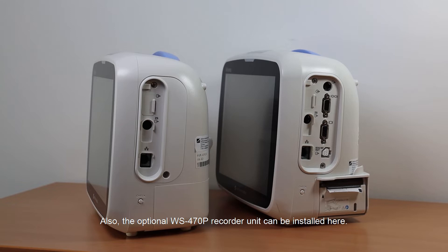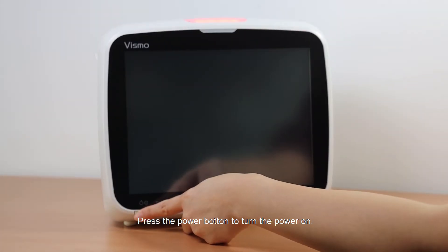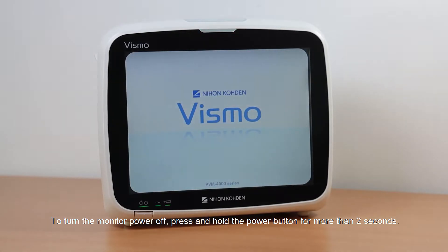The optional WS-4770P recorder unit can also be installed here. Press the power button to turn the power on. To turn the monitor power off, press and hold the power button for more than 2 seconds.